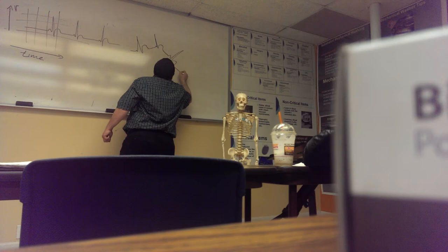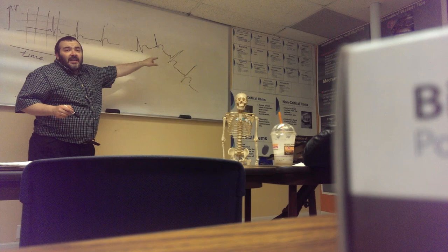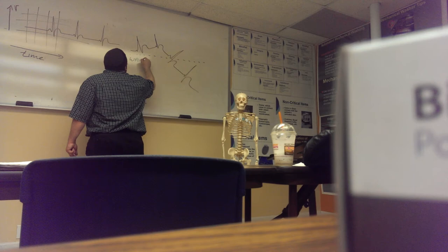Now, you see that we got all these ba-booms and then so on and so forth. We got all that stuff there. But instead of going along a straight imaginary baseline, this thing is wandering all over the place. You see that? So if my baseline is like this, this thing is right off the reservation, right? This has a name, and you will see it. This sucker is called the wandering baseline.